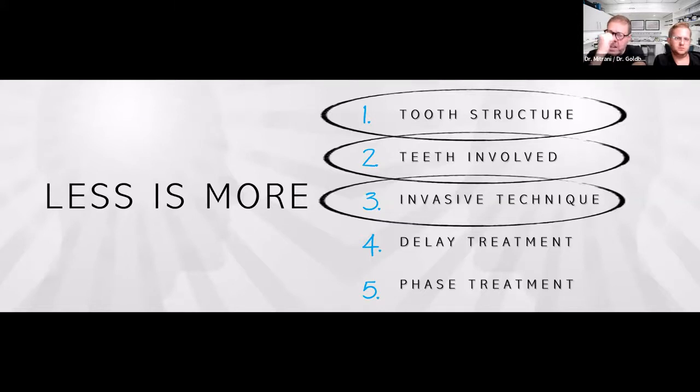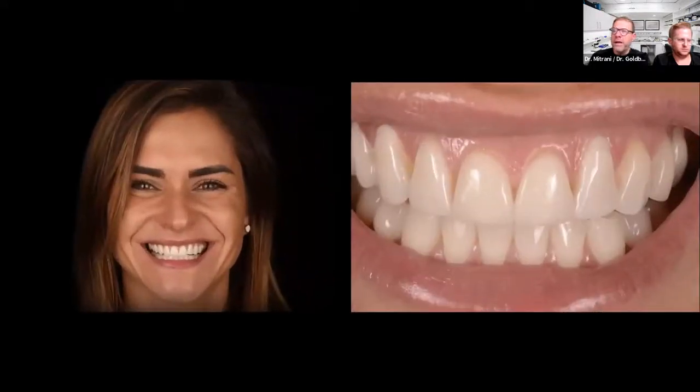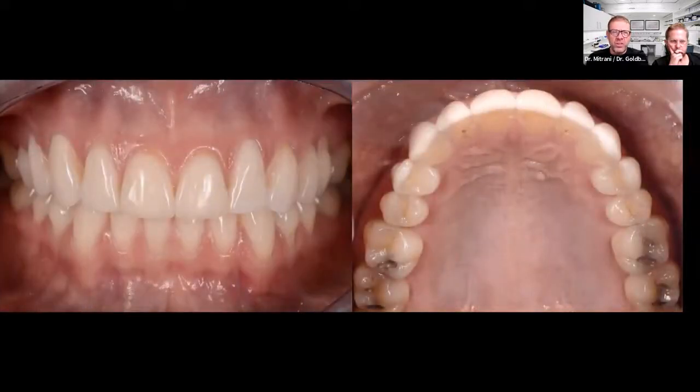And the veneers are always an option if and when she feels like she wants to customize her smile, adding some contour. And if that's the case, we would probably be able to do some restorations with as minimal preps as possible. And so with that in mind, we want to share this last case in which there are a lot of talking points. This is a patient that was previously treated, and she's concerned with the aesthetics of the veneers, but also she's concerned with the aspect of her soft tissues. You'll notice that there was some recession associated particularly with the lateral incisors.